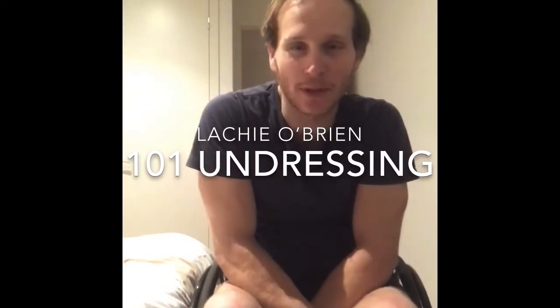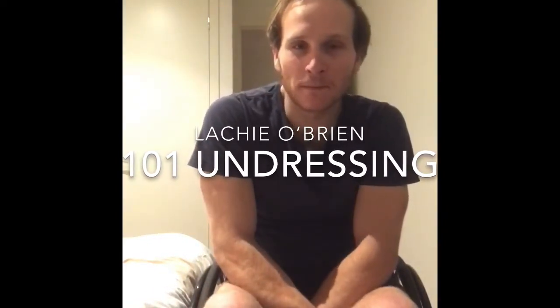Hi guys, it's Lachie O'Brien here. I hope you're doing well. I talked to Josh the other day and thought a good idea would be to show you guys a video of how to get undressed in your wheelchair and dressed as well. I'll try and explain it step by step and do it as fast as I can. First, what I like to do is place my hands on my wheelchair.